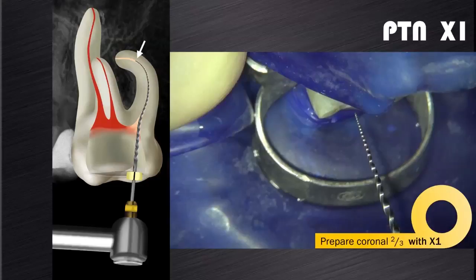After irrigation, recapitulation and a re-irrigation cycle, it is time to introduce the ProTaper Next X1 file into this challenging anatomy of this canal. In some cases you might find that the ProTaper Next X1 progresses normally down the complex canal, but in some cases you will feel from the tactile feedback, despite the coronal brushing motions, that the file still hangs up and does not really want to progress.